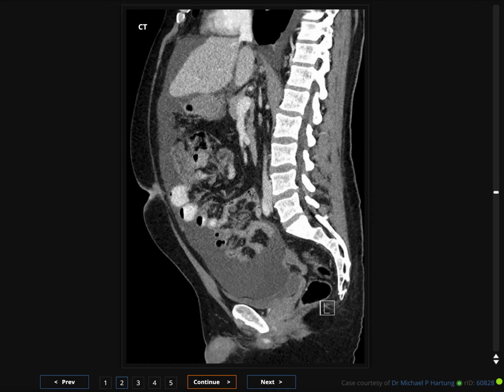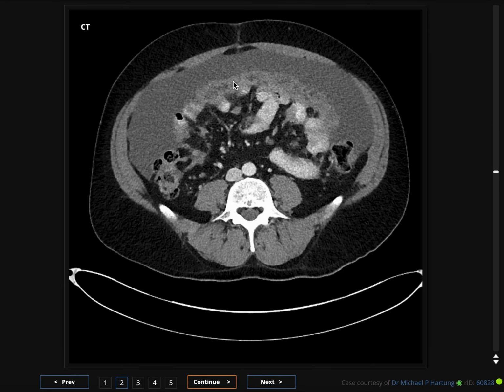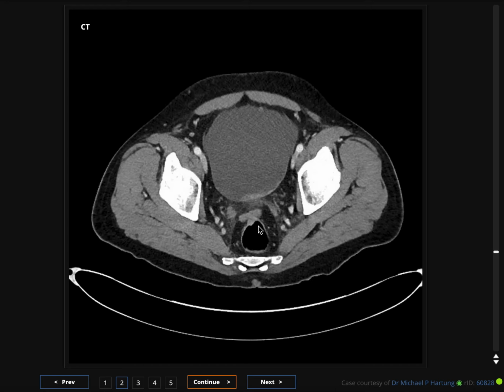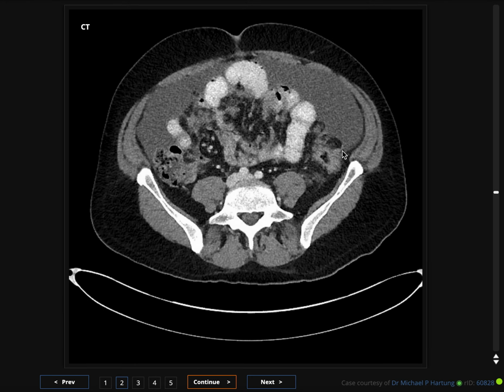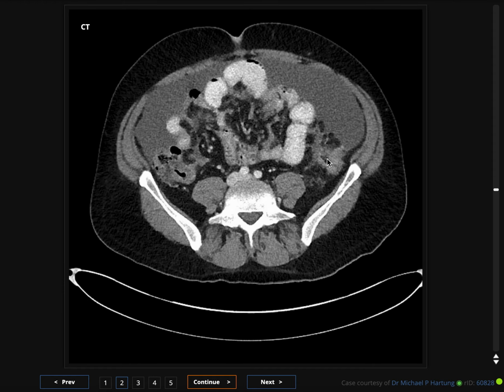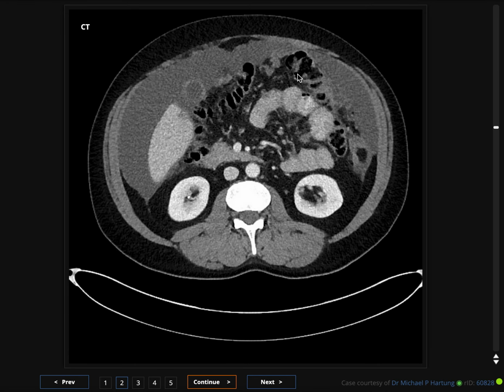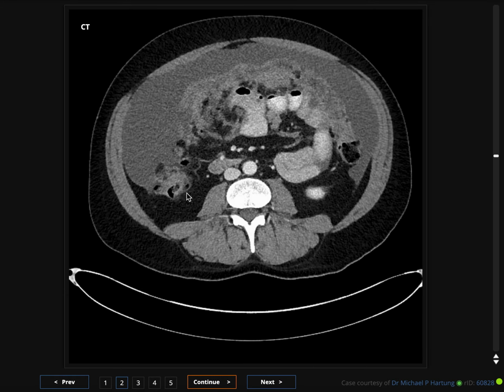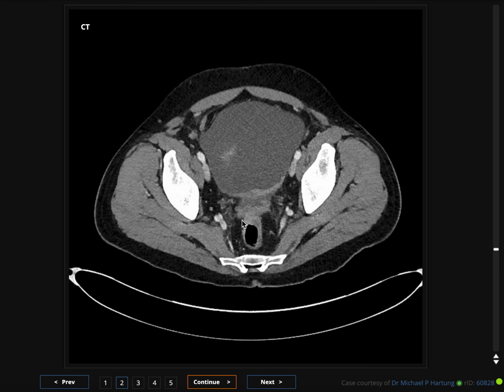Okay. So at this point, I'll just start my search pattern and go through all the organs. So we found some liver lesions, ascites, omental nodularity, top differential is cancer. Let's just follow the colon real quick because colon cancer could be a culprit. I'm just following, I didn't see anything that really jumps out at me. Here, is there some colonic wall thickening? Hard to tell. I am not convinced. Maybe someone who is more experienced could tell more confidently if that's normal or abnormal, but that doesn't jump out to me. Here too, is there some thickening? I'm not so sure. I don't think I would call that. So nothing in the colon jumps out to me.